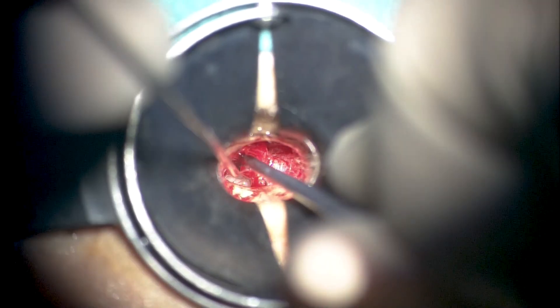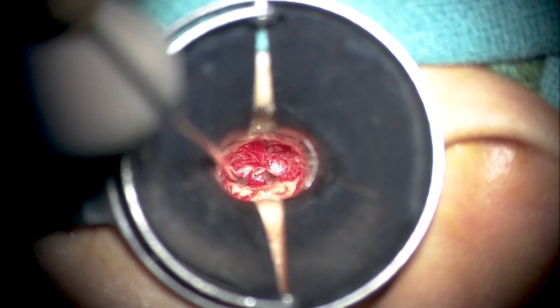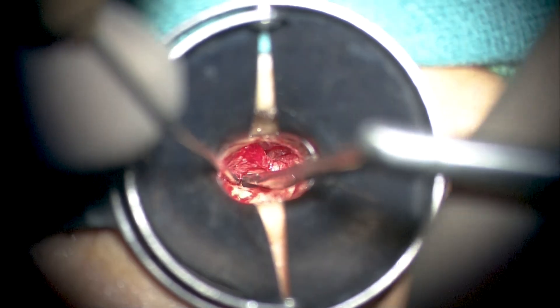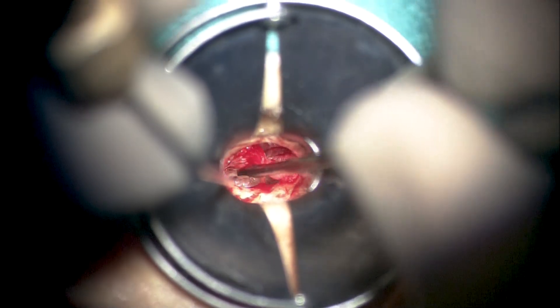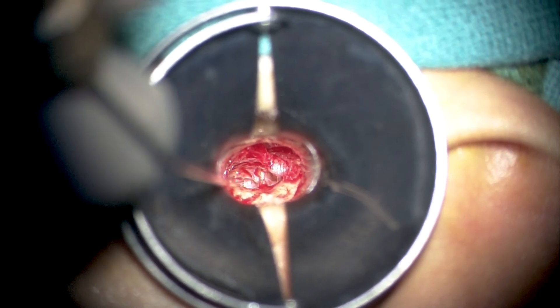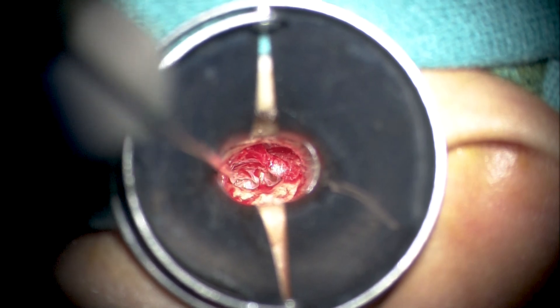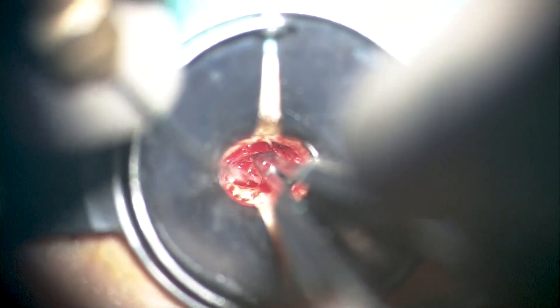Since we need to place a full-thickness cartilage graft to augment the posterior superior pars tensa, either the chorda must be transected or the epithelium must be elevated from the chorda for the cartilage graft to go medial to the pars tensa. Too much traction on the chorda can cause gross desiccation and loss of function even if the nerve is kept intact. We therefore recommend using more sharp dissection and less blunt dissection over the chorda, to be able to lift the pars tensa cleanly, as too much pressure from blunt dissection can easily desiccate and stretch the chorda, causing eventual loss of function even with an intact nerve.